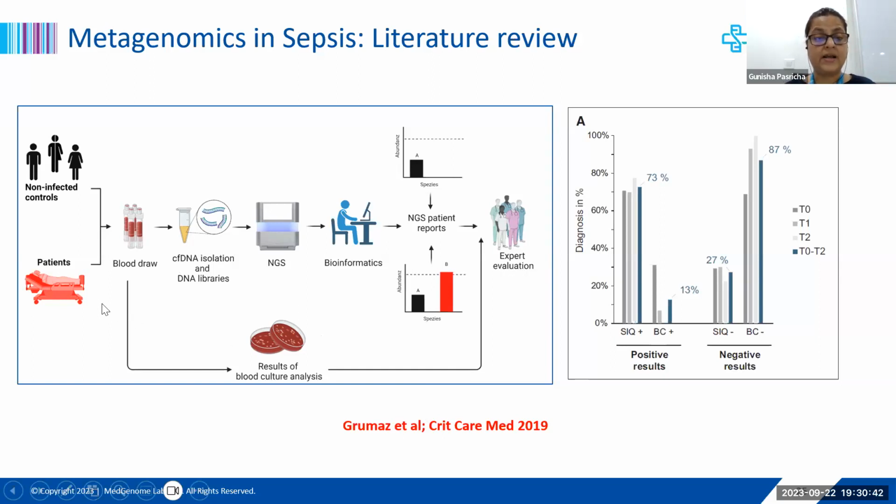However, as I mentioned, it is very important to have controls as well as the patient. Each patient sample has to be run with a control, either a non-infected control or controls added from the laboratory side, and then we understand which microbes are present in the non-infected or non-template control, and what is actually present in the patient's sample.